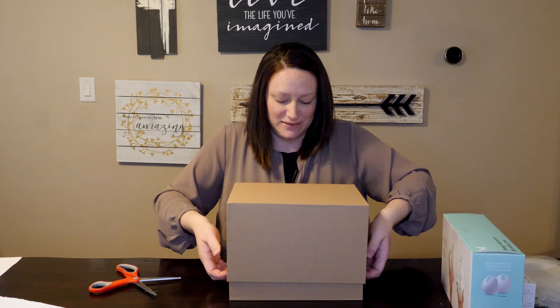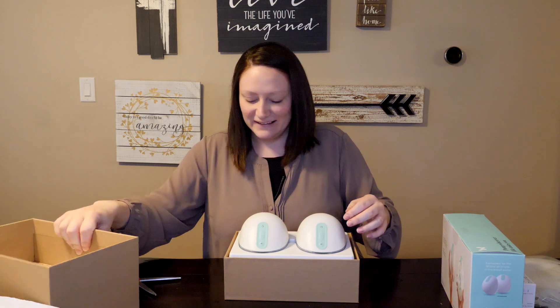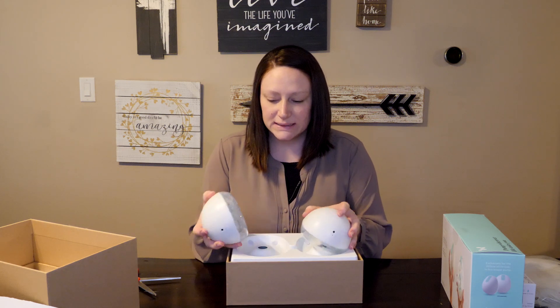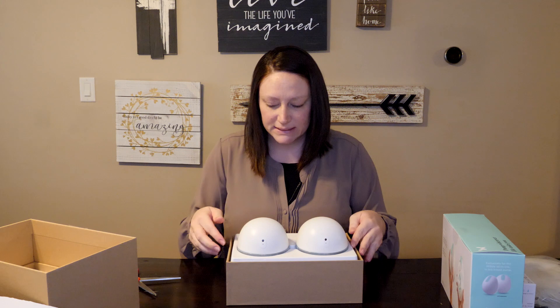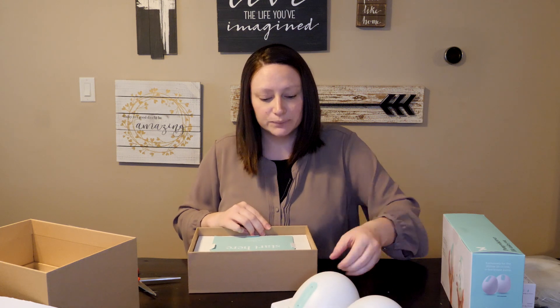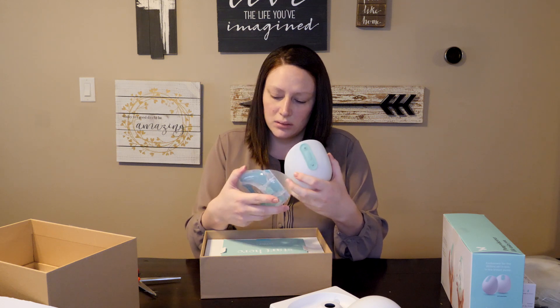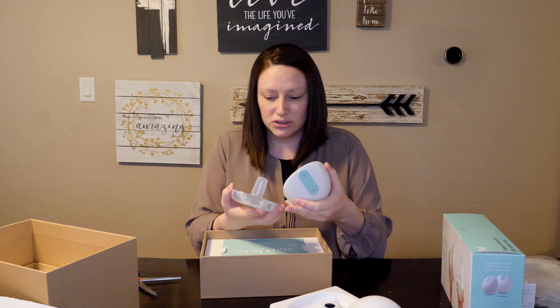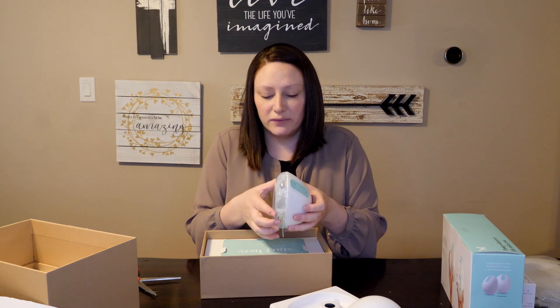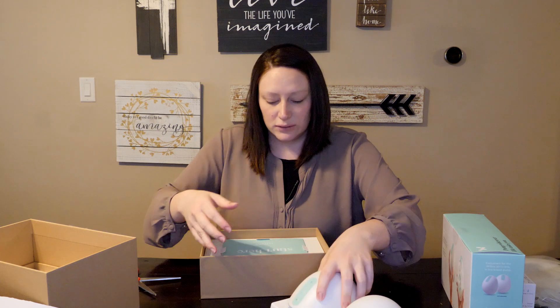My husband is trying to keep my baby occupied, so if you can hear her crying, that's him trying to comfort her. First impression: very sleek. It comes with two pumps — you don't have to buy two separate ones, it comes with two. On the inside it's got a piece of paper that just says 'pumping reimagined.' I didn't realize this until I was watching a video earlier, but it's magnetic, which is really cool — it just kind of pops together. There's no snapping or anything, which is really neat.